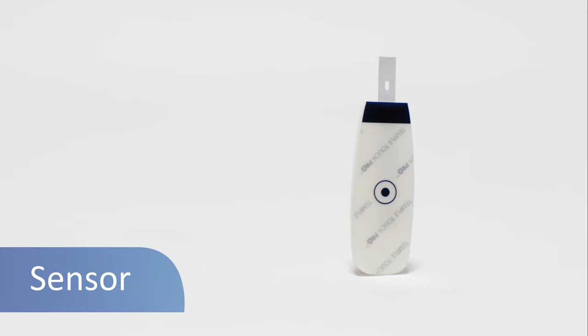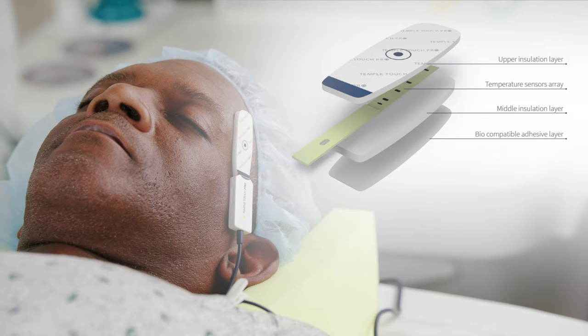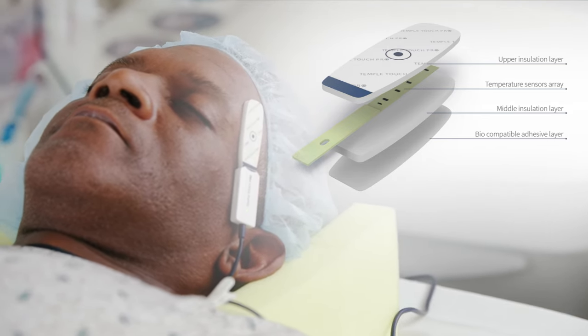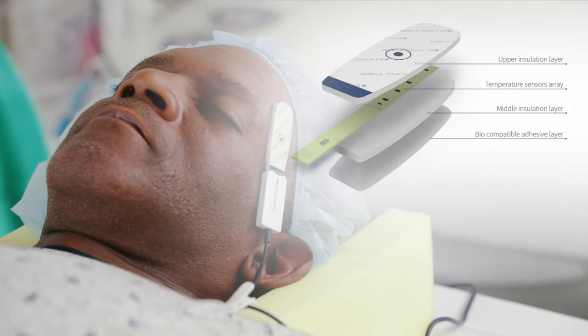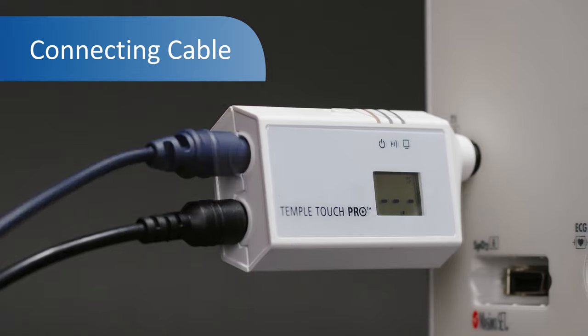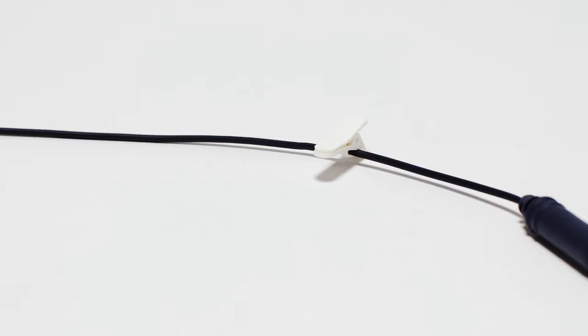The sensor is a non-sterile, disposable device placed on the patient's temple. It is comprised of multiple receptors that measure both the skin surface temperature over the temporal artery and ambient temperature. The sensor is connected to the MCU via the connecting cable, which can be secured to the patient's gown with the provided clip.